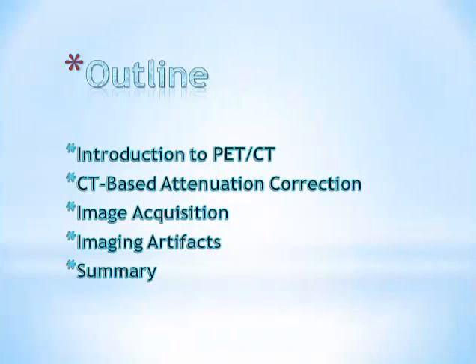Basically, I will talk about the principles of PET-CT images and the CT-based attenuation correction codes. Then I will describe the artifacts related with PET-CT imaging, and then I'll summarize it by giving some recommendations to the technologists on how to deal with these artifacts.